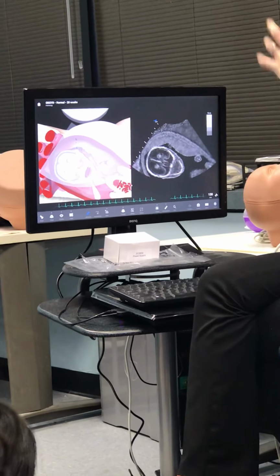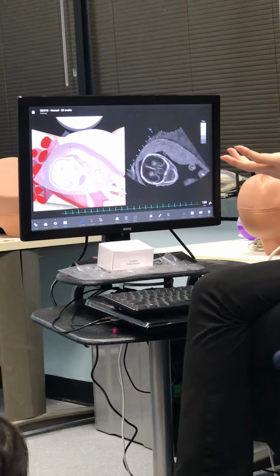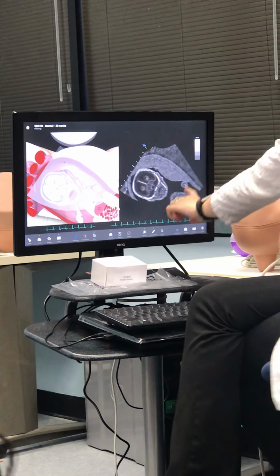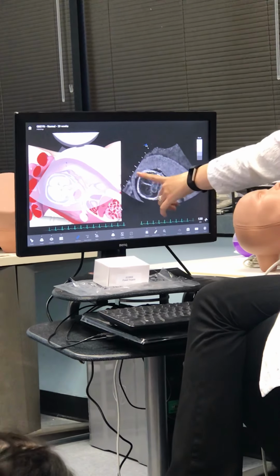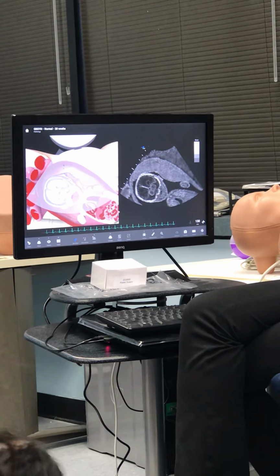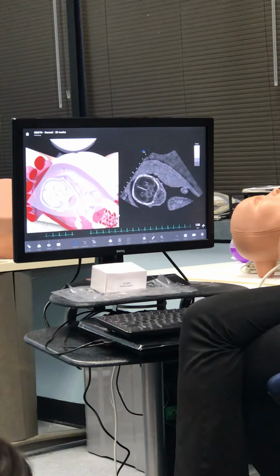Placenta position is something that's important when we're talking about delivery management. We're wanting to make sure that it's not laying over the top of the cervix. When you're doing a real study, you are wanting to show upper and lower margins of the placenta. Lower, upper margin. Demonstrating that they are far away from the cervix. Or if it's close to the cervix, showing how close to the cervix, okay?